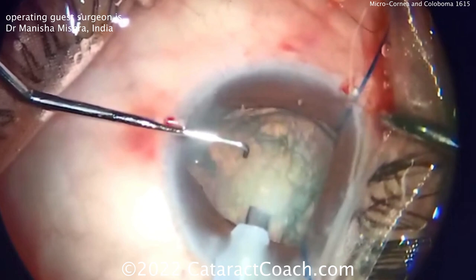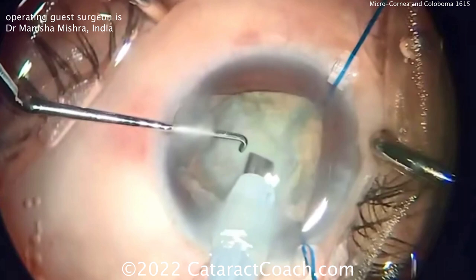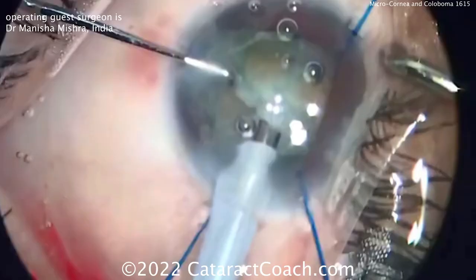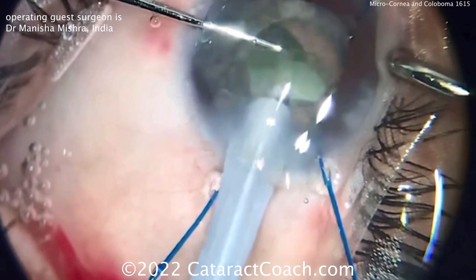Here comes the phaco probe — let's see some phaco. Looks like maybe a groove down the middle, perhaps a stop-and-chop technique. Another iris hook — always good to have improved visualization. Now bringing that nucleus up a little bit, using a chop technique. I'd like to get this nucleus up out of that bag to a good degree, and just be cautious — this is a very tough case.